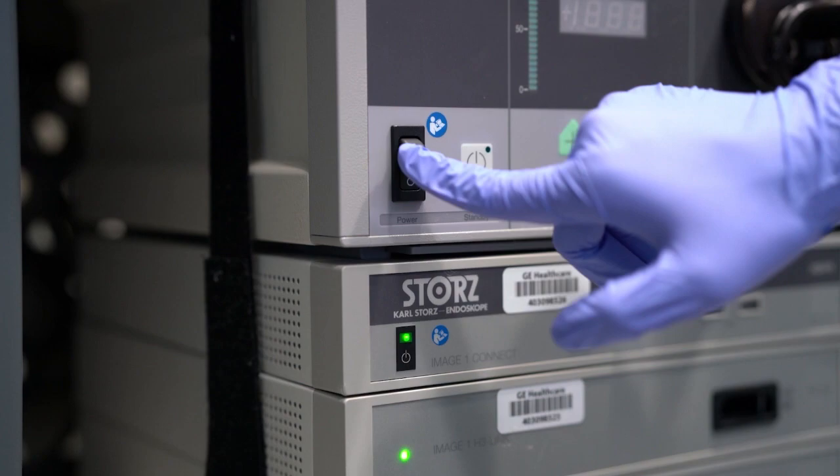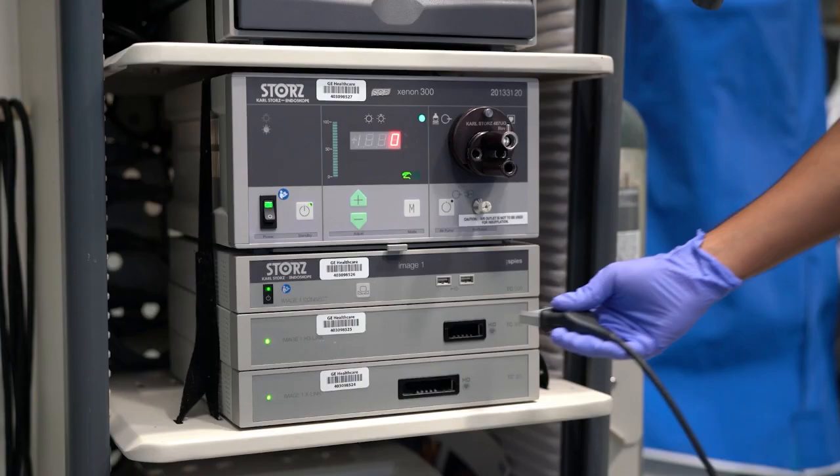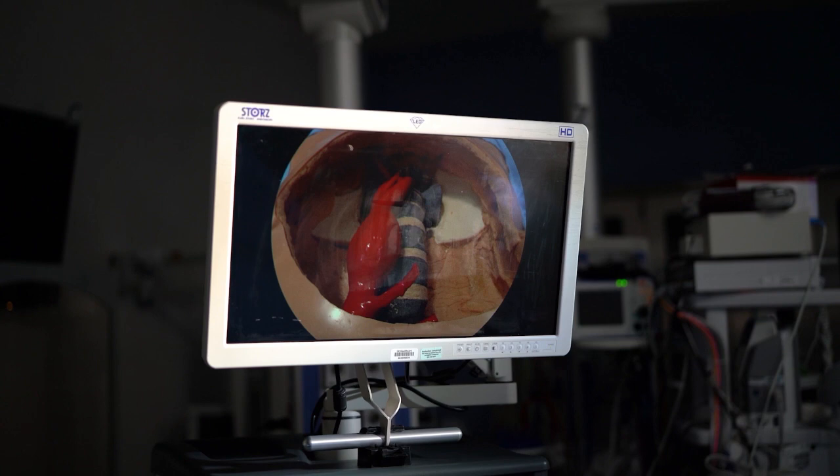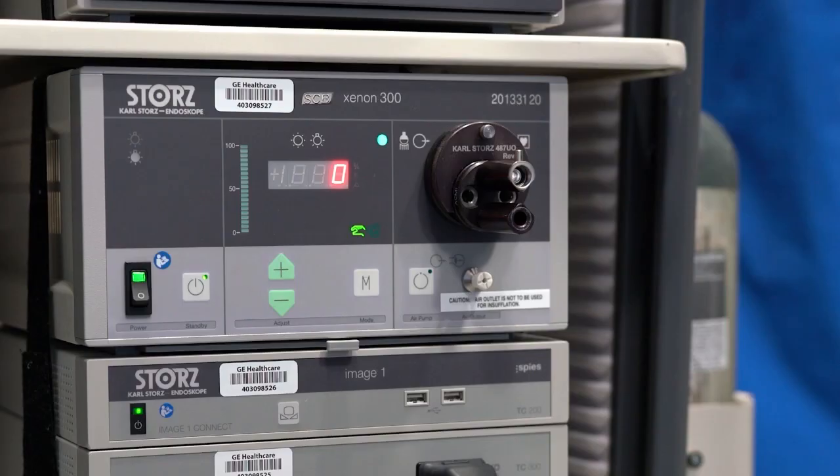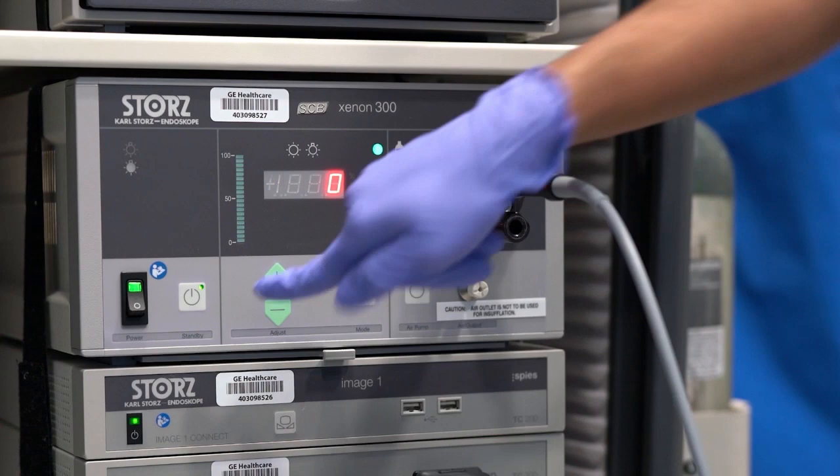Here you can see we're turning on and plugging in the camera. In addition to that, we then attach the light source and the light cable. Again, this is just a standard laparoscopic setup. Sometimes these are integrated into the room; sometimes just an endoscopy tower can be brought in. Here we're turning up the light.